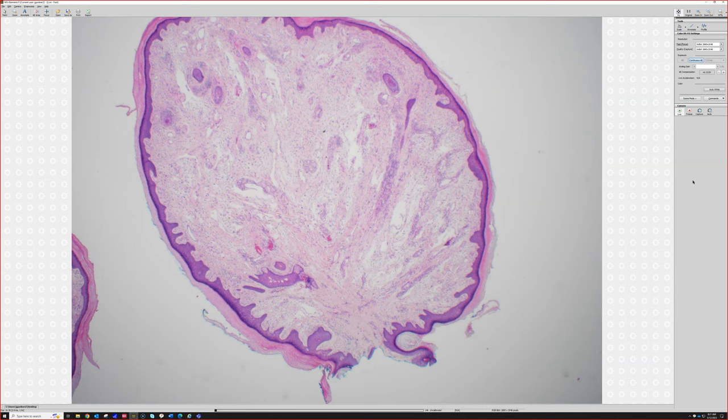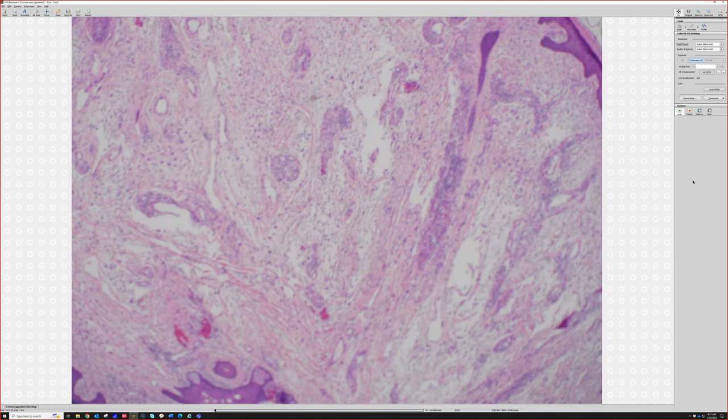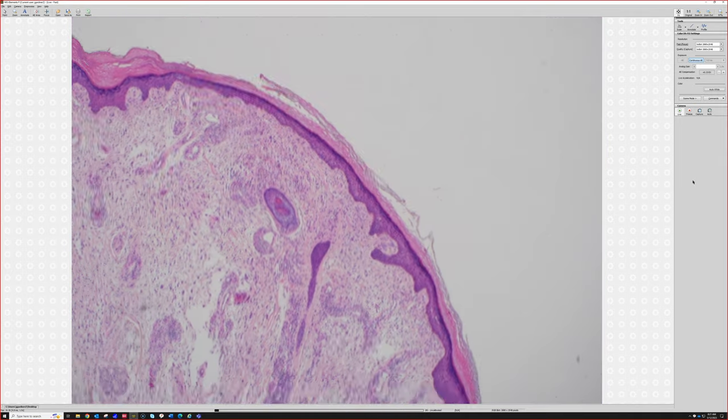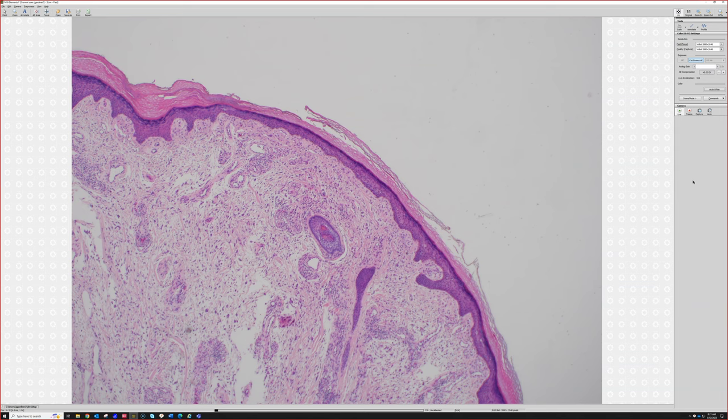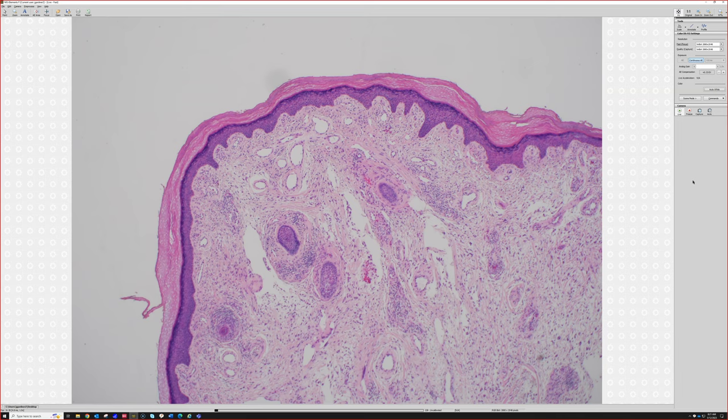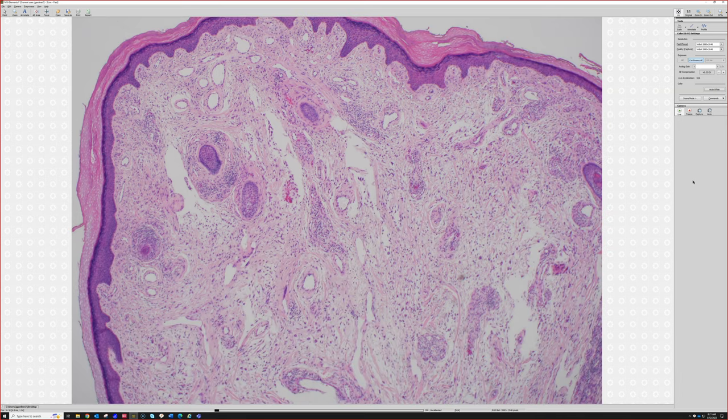But sometimes they can have a little stalk, look at the little stalk here. It looks almost like a skin tag, you know? But definitely doesn't look like a skin tag in the middle of it. For one, this was probably on the nose. See, we've got some little hair follicles with sebaceous glands in it, which is also evidence that it's probably not a tag, because tags conventionally are thought to not have adnexal structures in them. And then we see dilated blood vessels, dense collagen background, and kind of plump spindle to stellate cells. Some combination of those three features present in variable amounts and variable patterns.